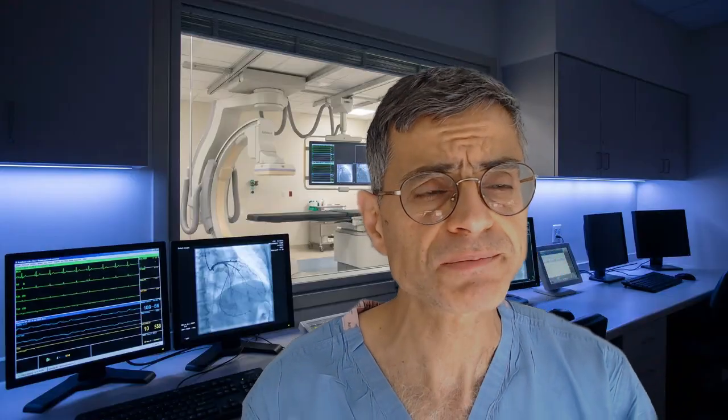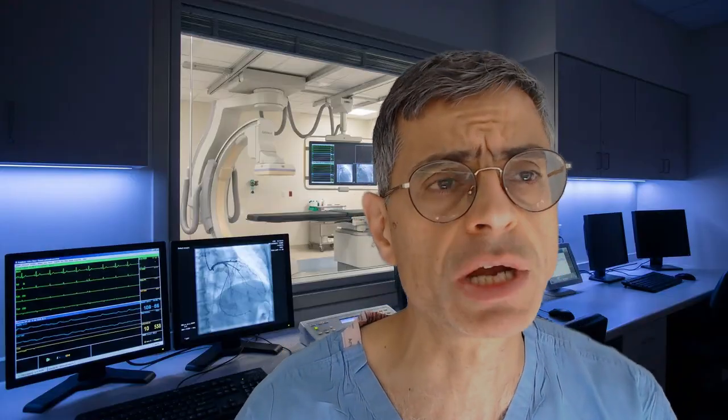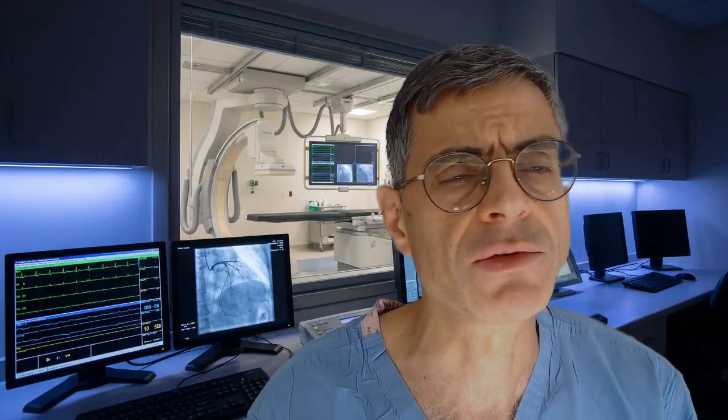have essentially a way to do experiments before going to the patient. That can be a revolutionary tool because you can experiment and say, okay, if I use a 15 stent, I'm going to get a post-PCI FFR of 0.80, but if I do a 38 stent, I'm going to get a post-PCI FFR of 0.95. So this can dramatically change what we do before we even get the patient into the cath procedure.